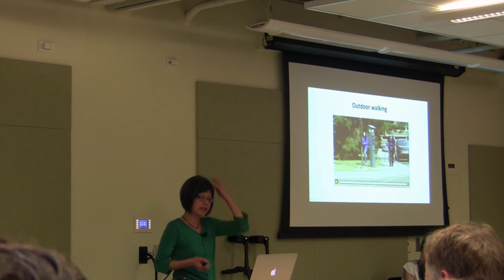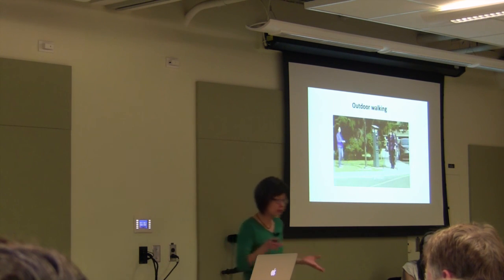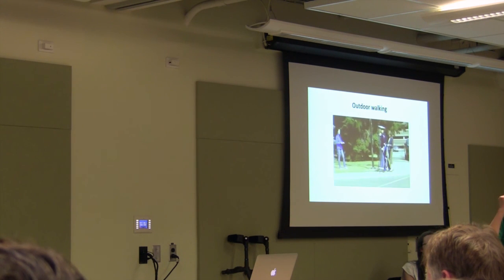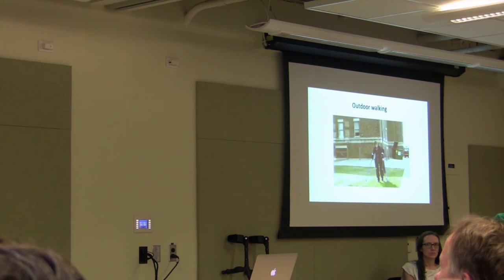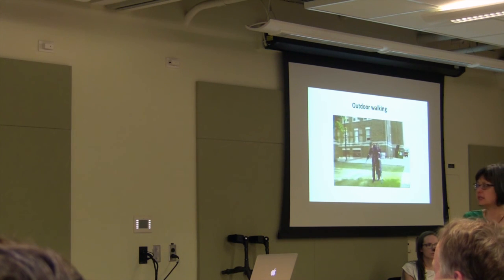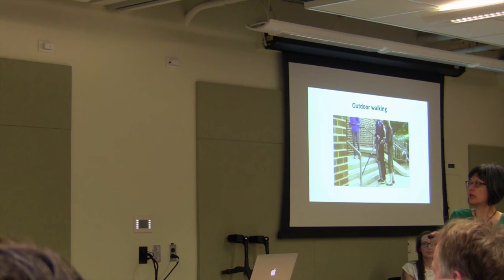She's walking outside, and all 5 of our participants so far have been able to walk outside without too much trouble, to my surprise, actually, even though the sidewalk is uneven. And you'll see that she can walk on grass, and most of them can do that too. It's a little bit harder on grass. And then you will see her trying to do stairs.